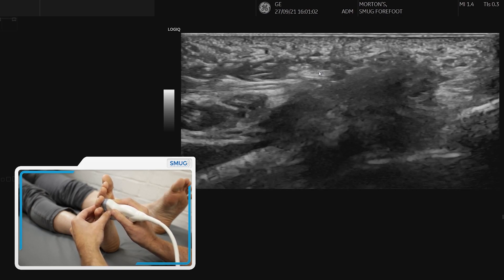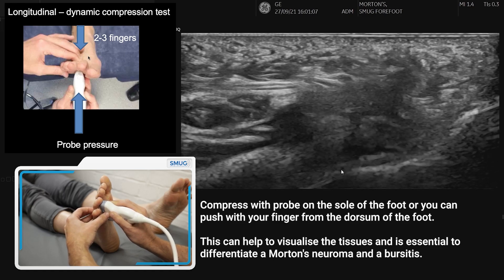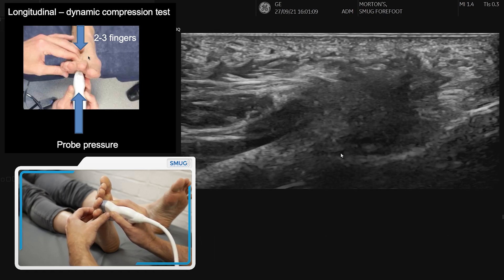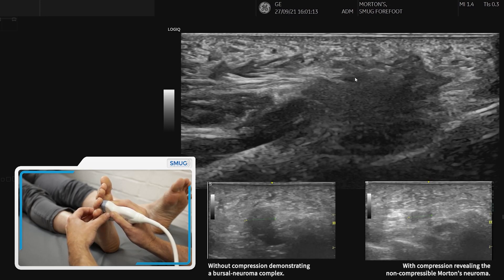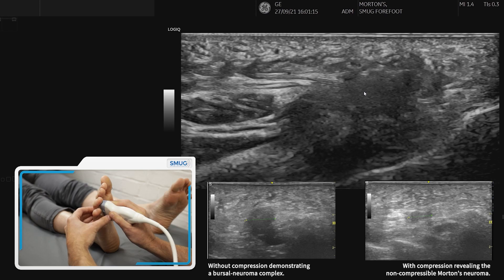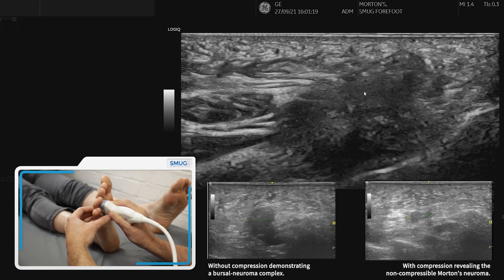We can compress with the probe, or what I find quite useful is to compress with my finger — that will tell us whether the lesion is compressible or non-compressible, giving us information on whether there's a neuroma, a bursa, or most commonly a bursal neuroma complex.